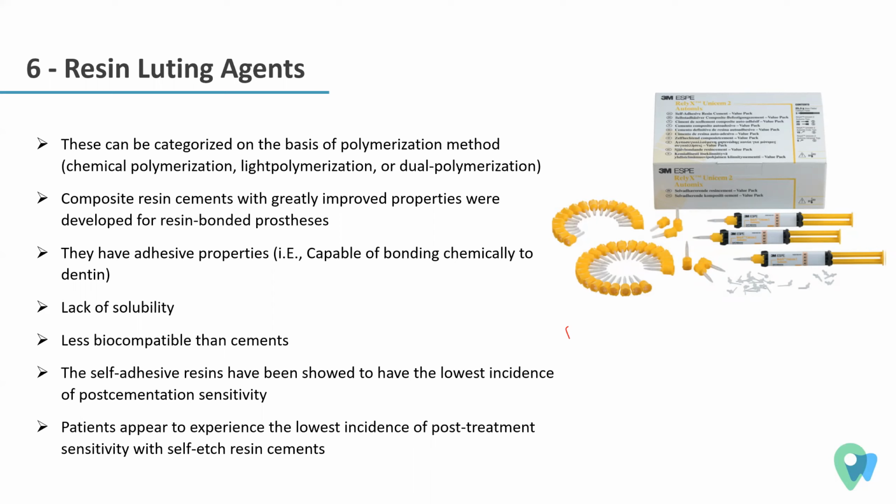The self-adhesive resins have been shown to have the lowest incidence of post-cementation sensitivity. Patients appear to experience the lowest incidence of post-treatment sensitivity with self-etch resin cements.